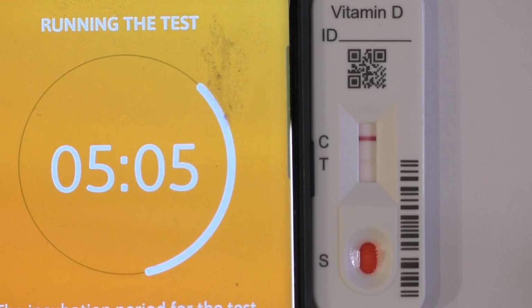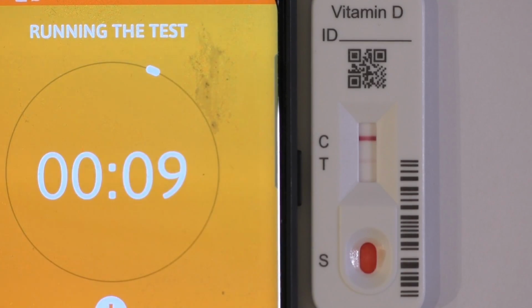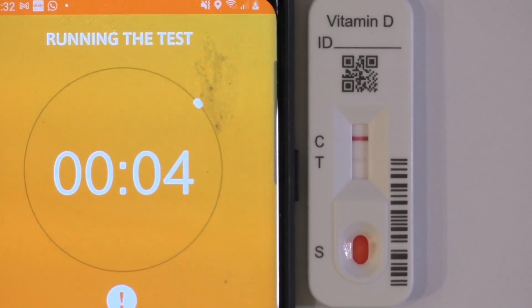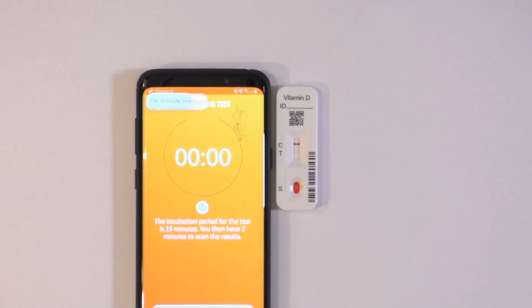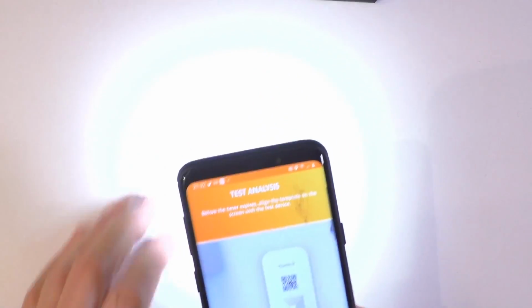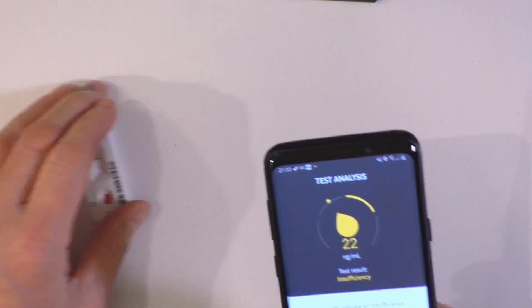Still waiting. So, nearly done. 10 seconds. Then we'll have to scan it to get the results after this. We've got a 2-minute window in which to scan it, so we'd better get this right. Okay, scan test. How do we do this? There we go. There we go. So we've scanned it.